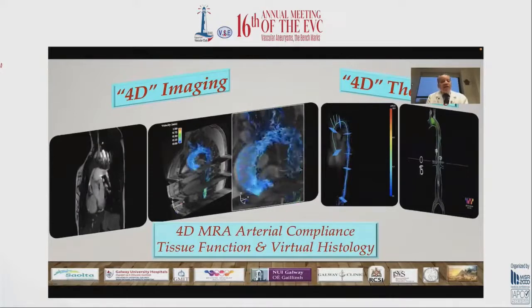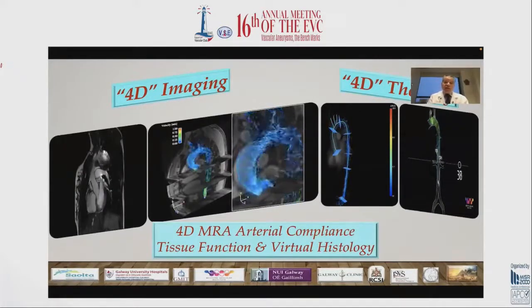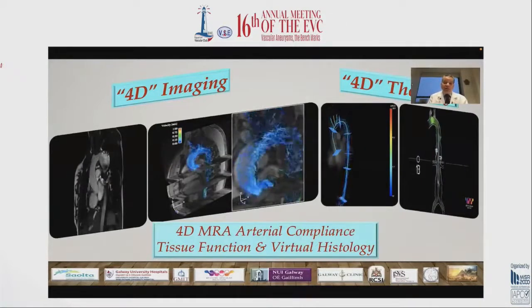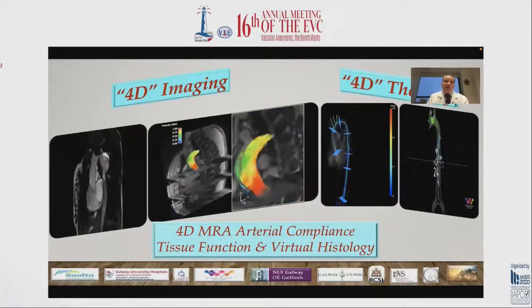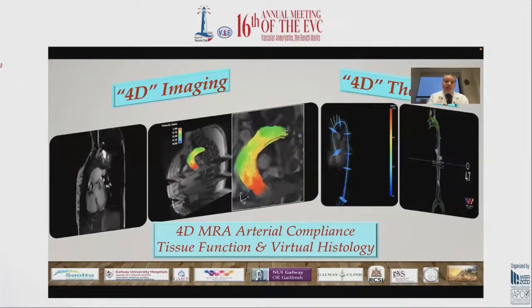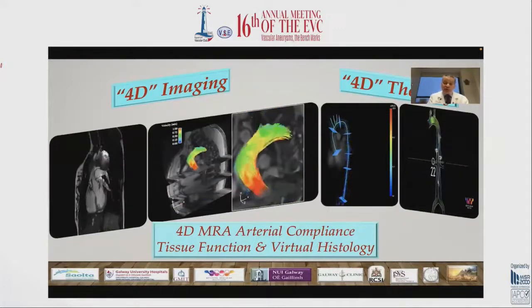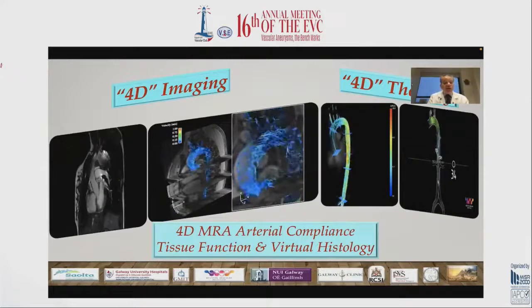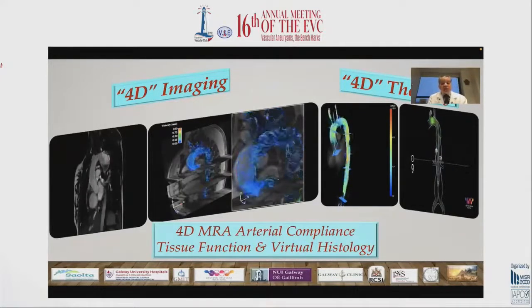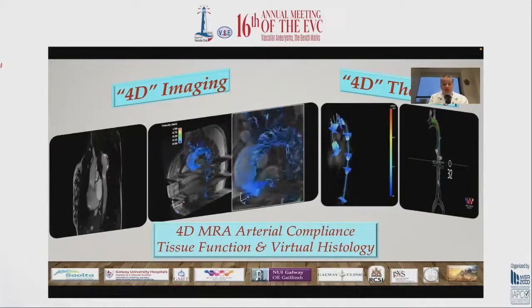All of us are currently doing 4D imaging, and the reason for that is to know exactly the dynamics. However, we haven't applied any 4D therapy, where the fourth dimension is time. We love to have an instantaneous completion angiogram that looks great, but we don't know how far this could cause a problem for the patient. Currently, there's 4D MRA arterial compliance. We could do 4D tissue function and virtual histology, but the therapy hasn't matched the diagnostic power that we have.